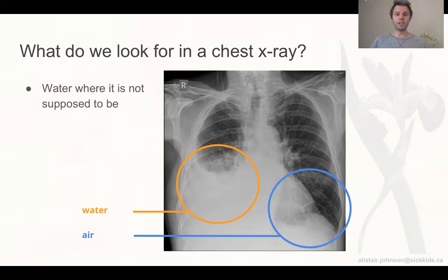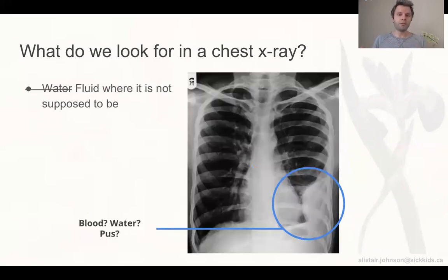But it's not necessarily just water, right? It could be any type of fluid, and you know, we're talking about the body, so it's not water that we're talking about. We're talking about sort of a general fluid, but in some contexts you can actually interpret that it may not be the sort of generic plasma. It may be blood sort of leaking into the lungs, or some sort of pus, and then you're interpreting it differently. So you're sort of using a lot of physical laws and physical principles to interpret this image and try and understand what's going on with the patient from the image.